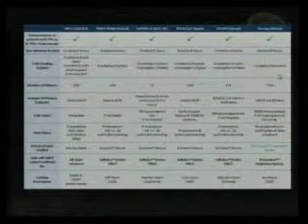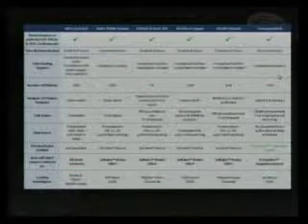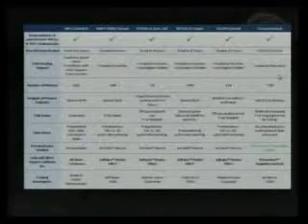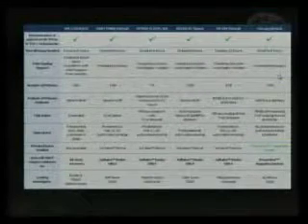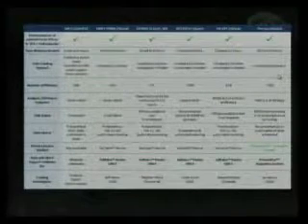So at the same time, there were 5 other studies going on, and all of those studies were halted in December of last year when the results of MR CLEAN came out. And all of these, except the last one, use the Solitaire device. Solitaire is a stent retriever. All of them use that, except that last one, so we're not going to touch on that last one, that uses a different system that is an aspiration system. Time window, 6 hours for most of them. Some of them went up to 8 hours, some of them went up to 12 hours, and of course all these studies had advanced imaging to support the treatment.